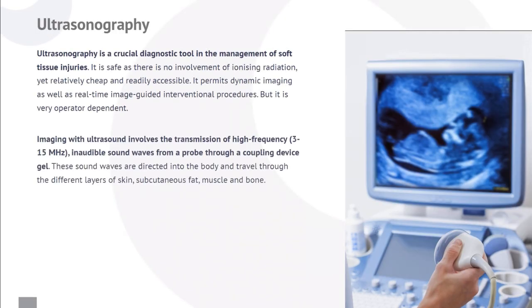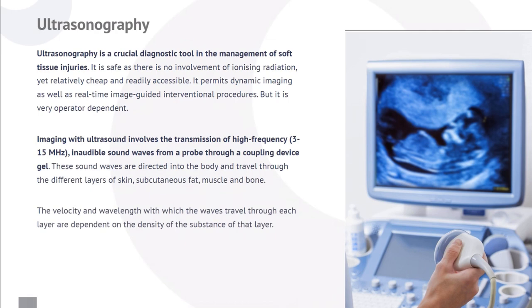Ultrasonography. Ultrasonography is a crucial diagnostic tool in the management of soft tissue injuries. It is safe as there is no involvement of ionizing radiation, yet relatively cheap and readily accessible. It permits dynamic imaging as well as real-time image-guided interventional procedures. But it is very operator-dependent.